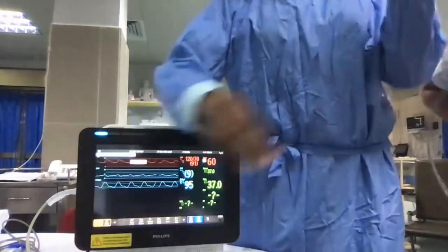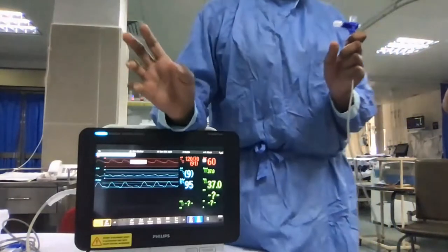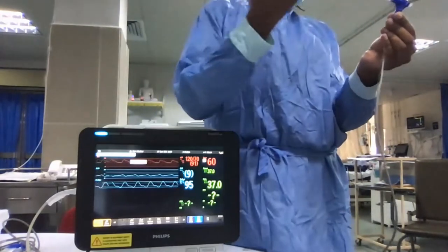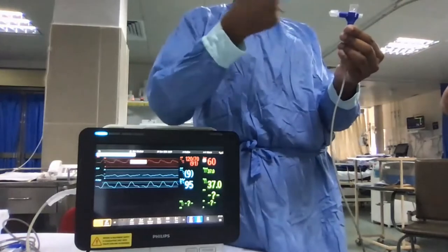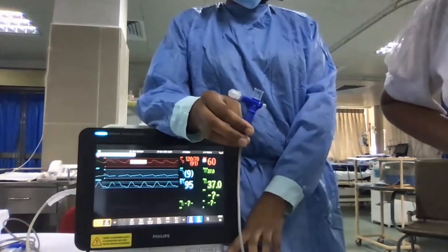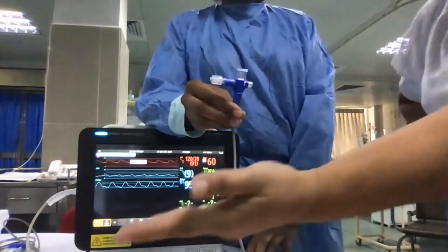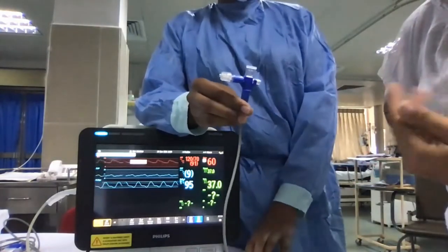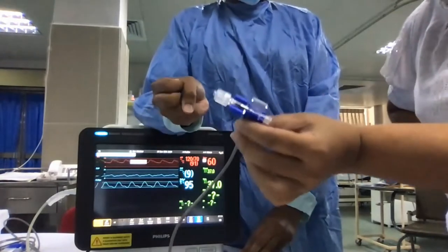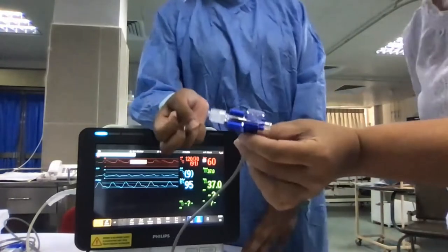So this goes into the CVP line of the patient. If you have a 3 or 4 way tap, I don't know how your procedure is, madam, but what we ask is we need the distal most lumen from the CVP line. If it is the normal central line, it is the brown one. So it should go to the brown port, which is the proximal most one for the patient and the distal most one for the operator. So this should connect onto the distal most port, and it should be through a 3-way tap.